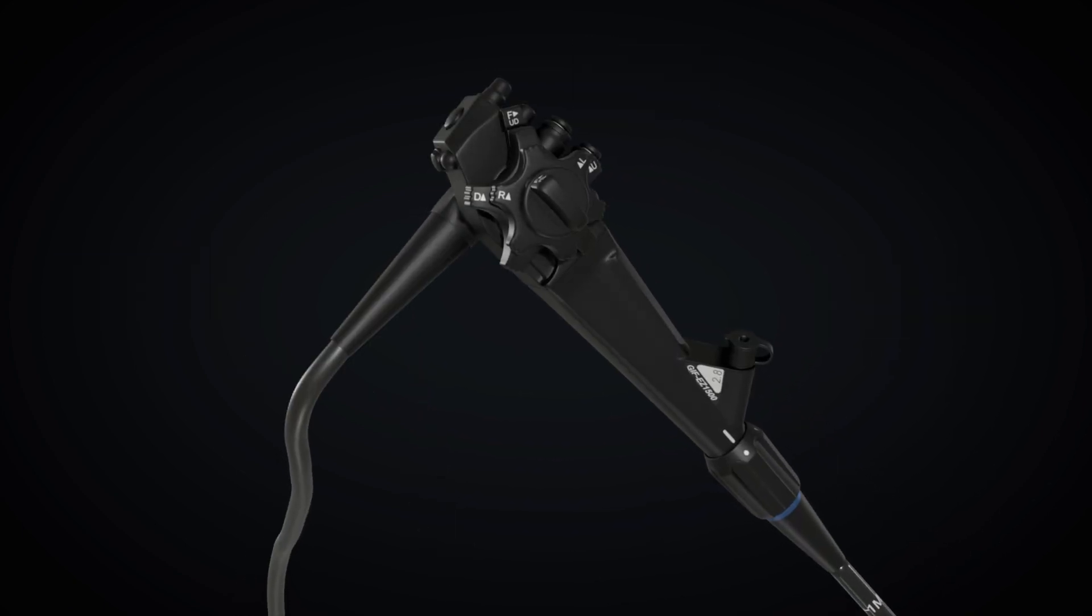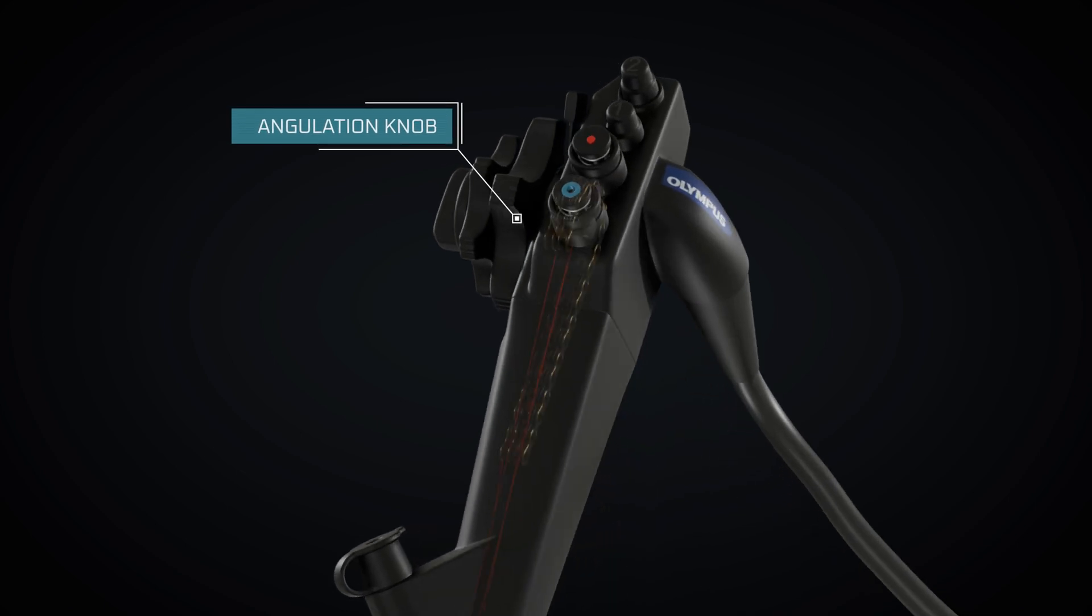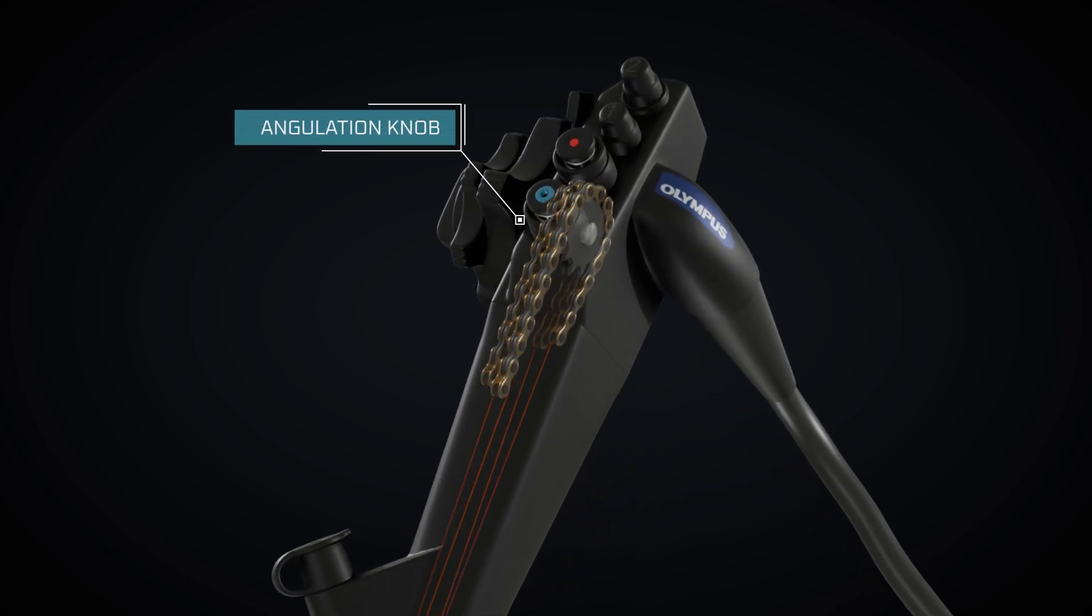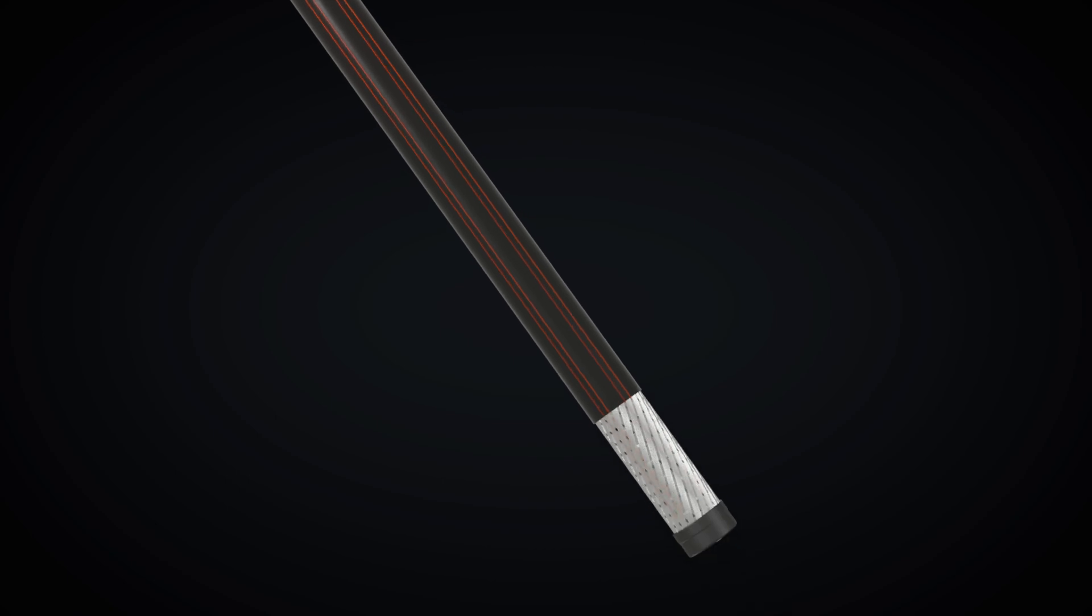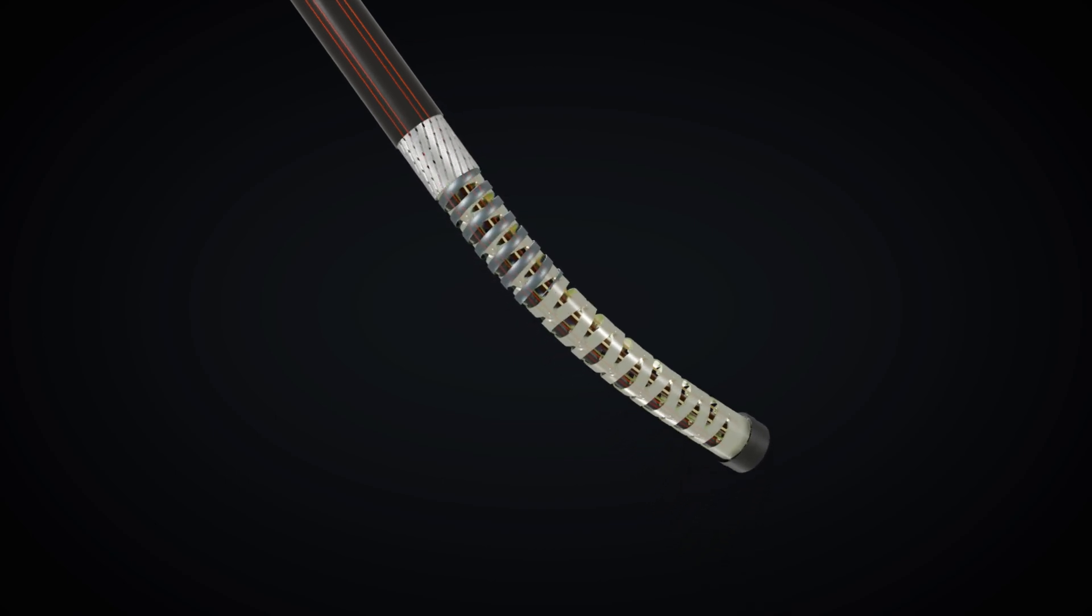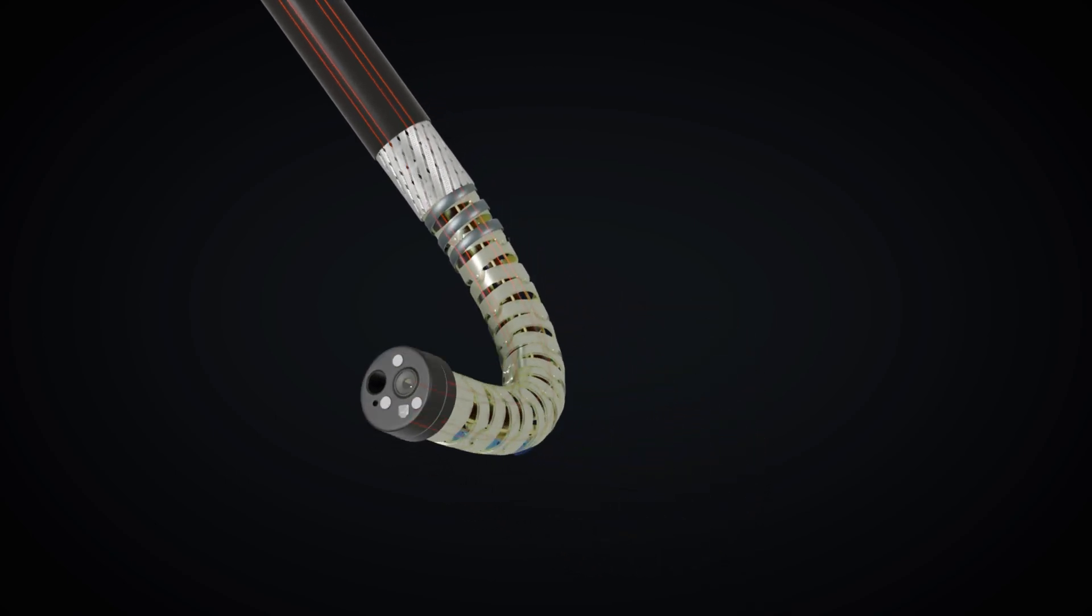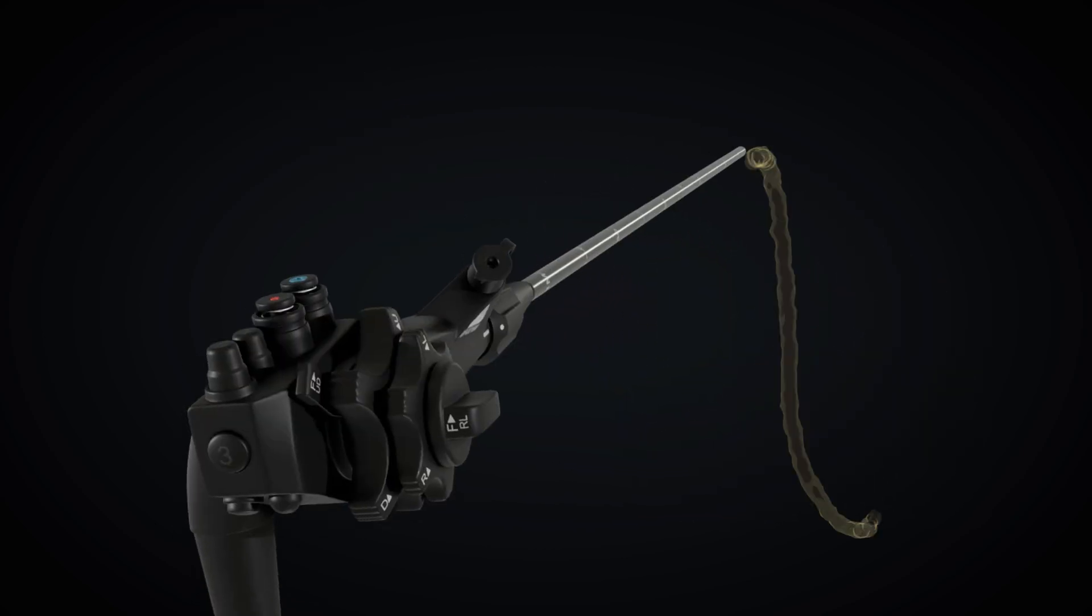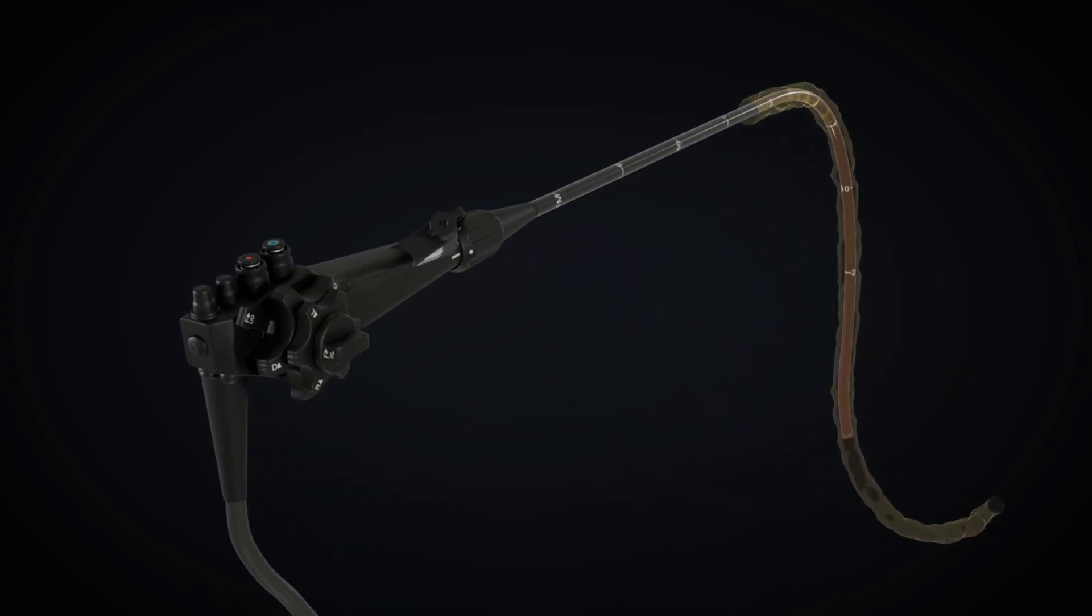The control section of the endoscope features an angulation knob linked to the endoscope's tip via a system of wires. Rotating this knob enables horizontal and vertical bending of the distal end, facilitating smooth insertion into the body and panoramic viewing within body cavities.